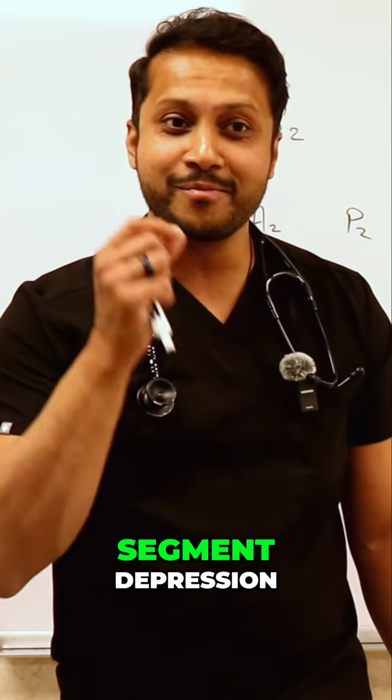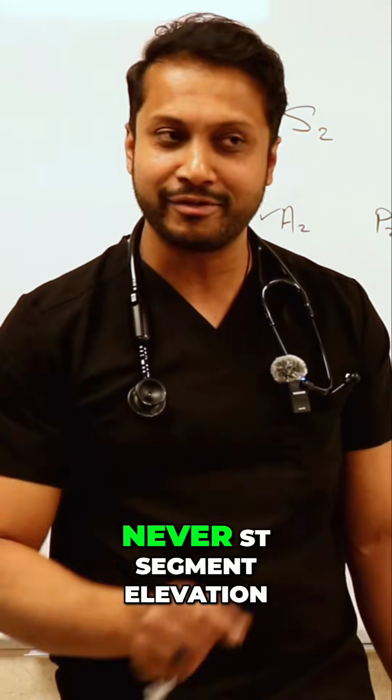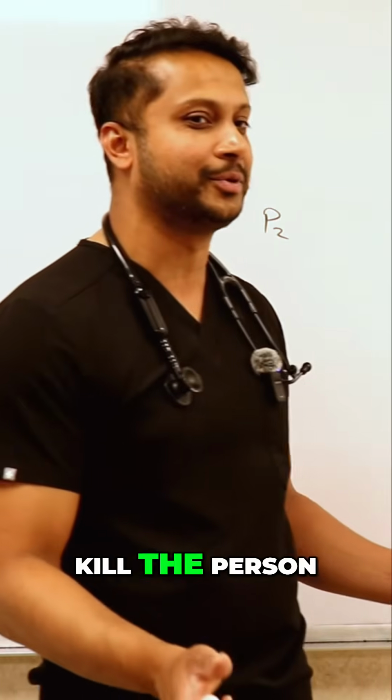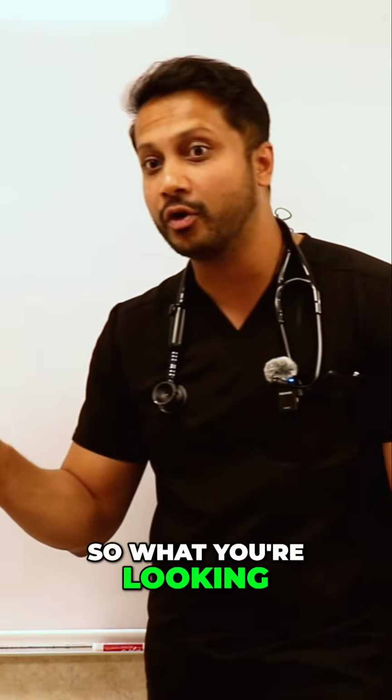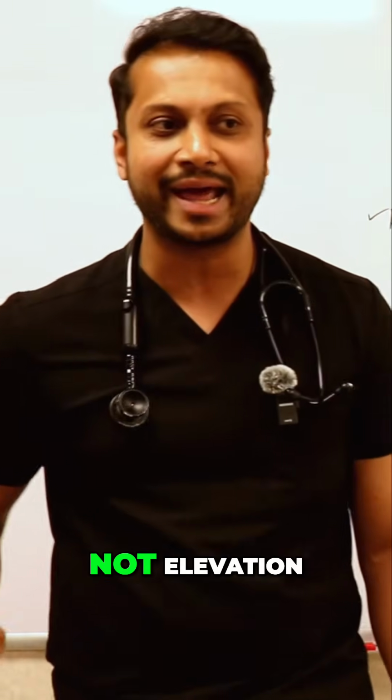You're looking for ST segment depression, okay? Never ST segment elevation. You're not trying to kill the person. You're trying to cause some ischemia, right? So what you're looking for is ST segment depression, not elevation.